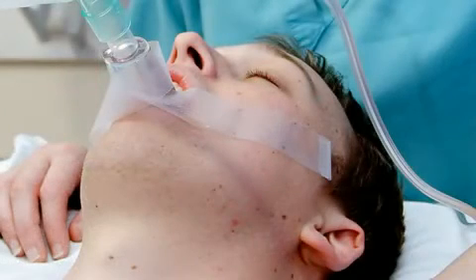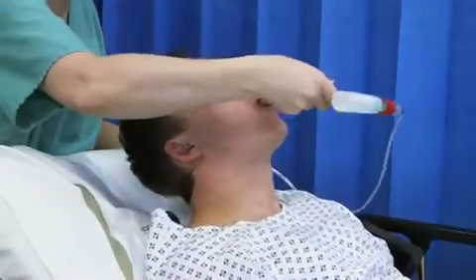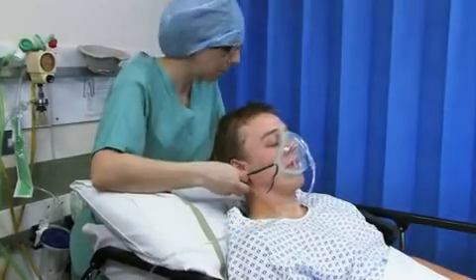Once the patient is taken into recovery, the patient's airway will need to be maintained and oxygen administered via a T-piece. The device, iGel or laryngeal mask, will need to be removed and oxygen delivered via an MC mask.